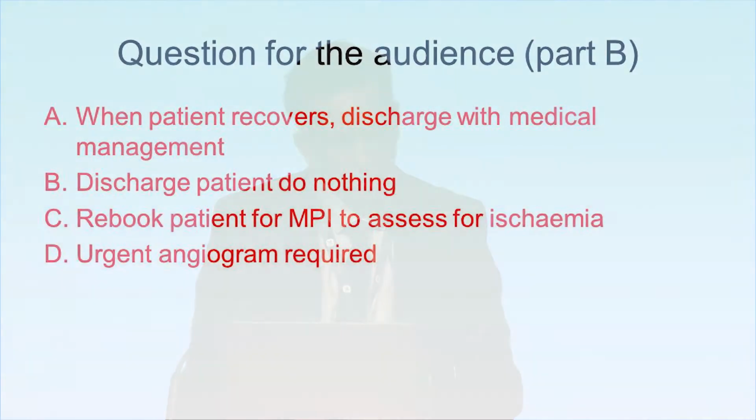Excellent. So you've gone for the positive DSE study with ischemia in RCA territory. That would be correct. I think a lot of people would have gone for that. But let's have a look at part B to this.